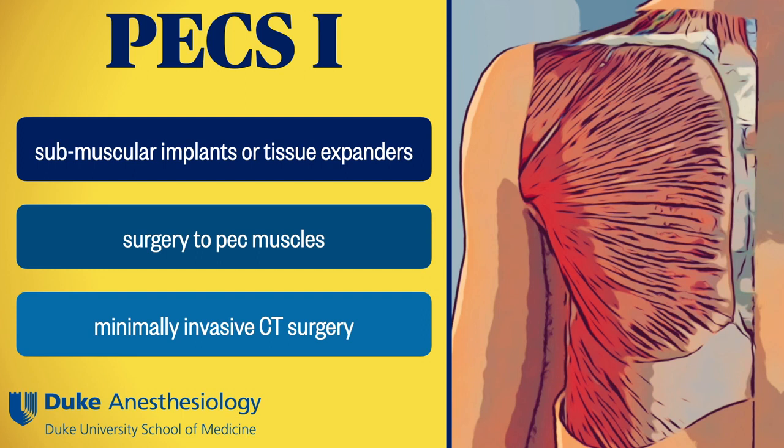PECS 1 is an excellent block for anything involving the PEC muscles themselves. We use them routinely for breast reconstruction with submuscular implants or tissue expanders, as it relieves that dull, achy sensation associated with stretching of the PEC. We'll also include the PECS 1 if the surgical oncologist is performing a modified radical mastectomy where the PEC major fascia is being stripped off the muscle. We've also had great success using this for thoracoscopic surgery and minimally invasive heart surgery.